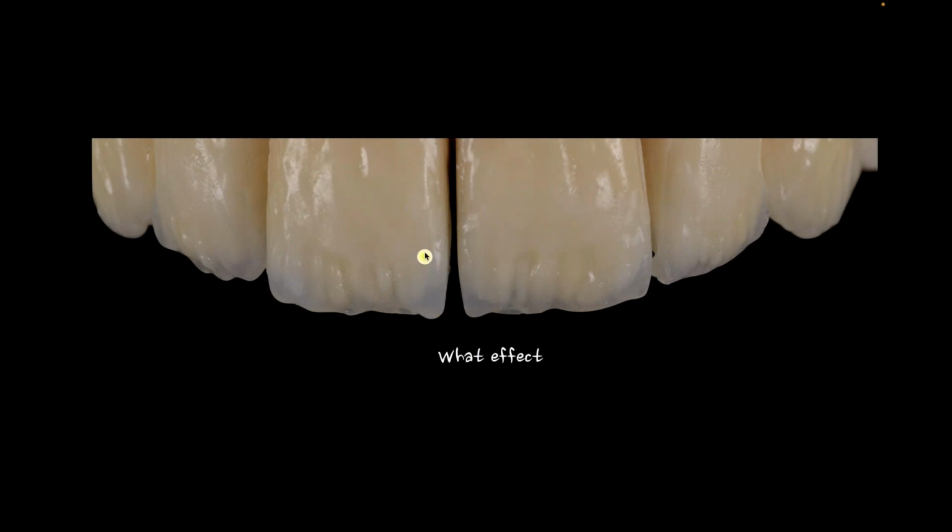So I'm creating some translucency, but notice how my mamelons are kind of clogging up everything else. I'm not having tons of translucency in there because I'm not really looking for that super translucent, very youthful looking tooth. I want kind of a little older tooth, although she does want a little brighter, whiter tooth. So look at what my mamelons did and how well they masked a lot of my translucency.